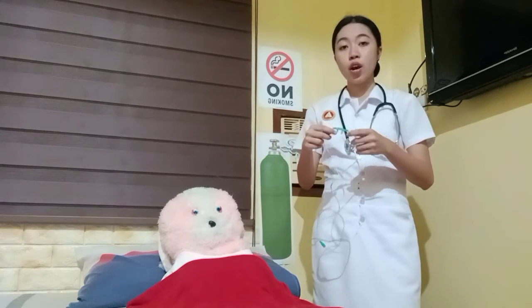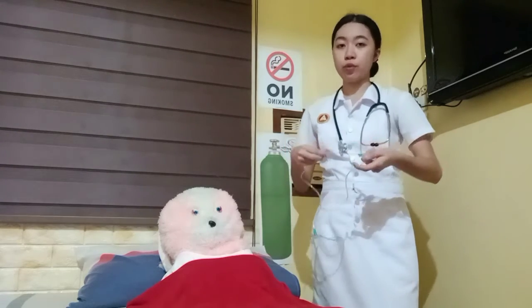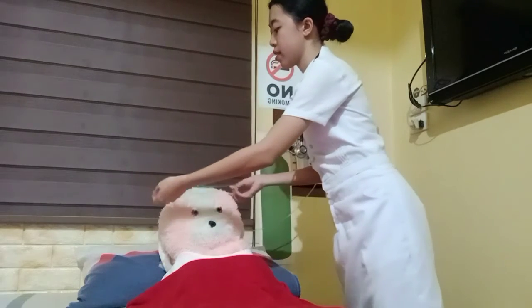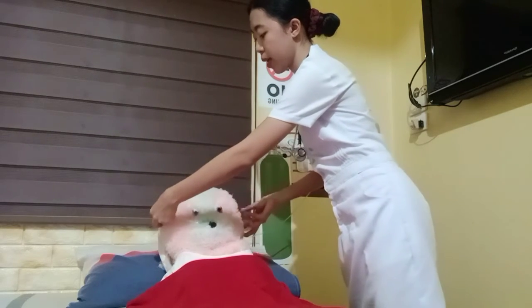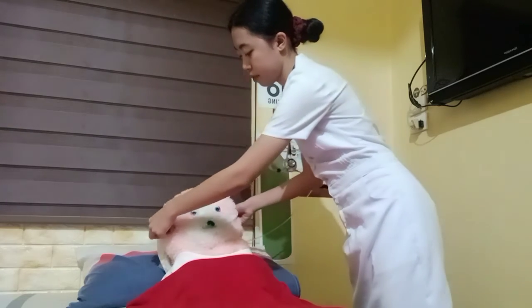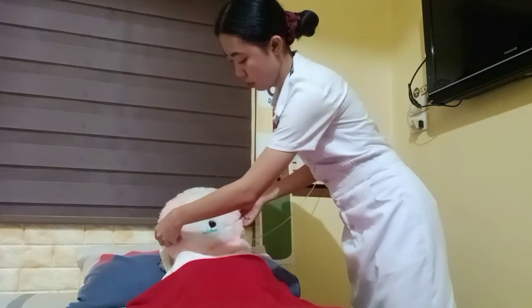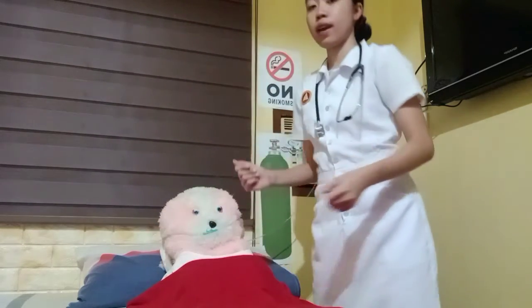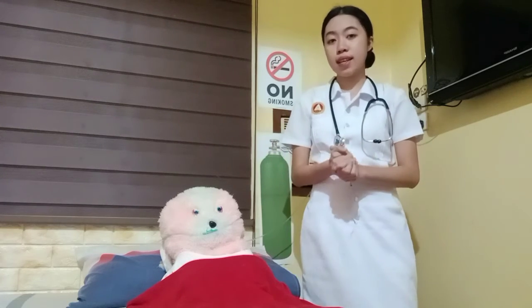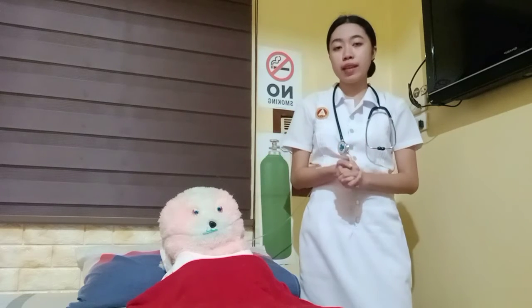So next, hold the nasal cannula in proper position with prongs curving downward, and then place the cannula into the nares. So wrap the tubing over and behind the ears. Okay, so place gauze at the ear beneath the tubing as necessary. So if prongs dislodge from the nares, replace promptly.